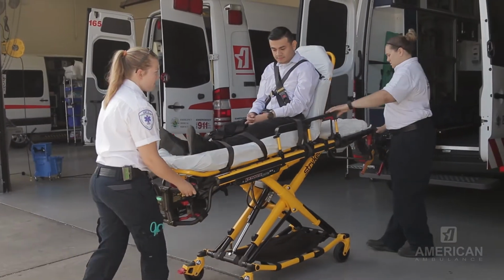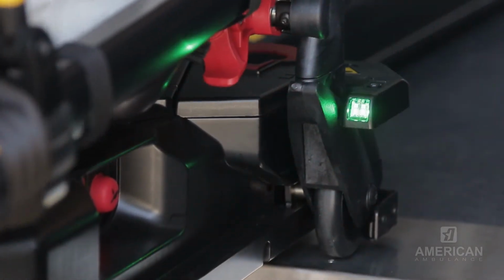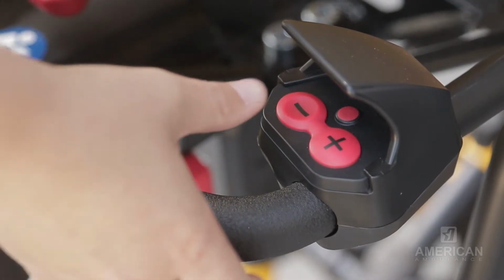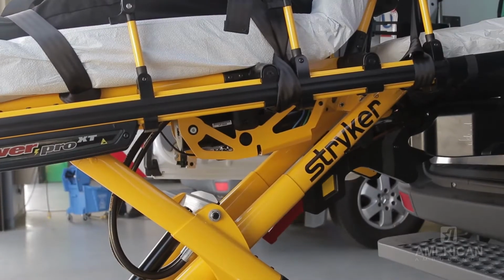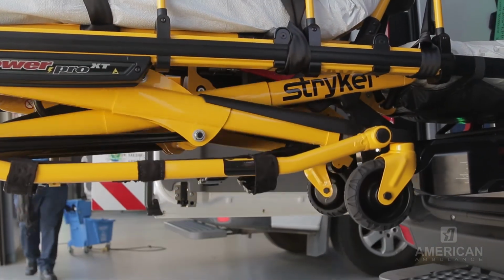Once it is in the proper position, the lights will be yellow. We're going to move the gurney into a locked position. When the gurney is locked in the glide system, the lights will turn green. When you have 2 green lights, you're ready to raise the legs. You're simply going to hit the minus button, and the loading arms will come underneath the gurney and position themselves onto the gurney. Automatically, the legs will raise on their own.